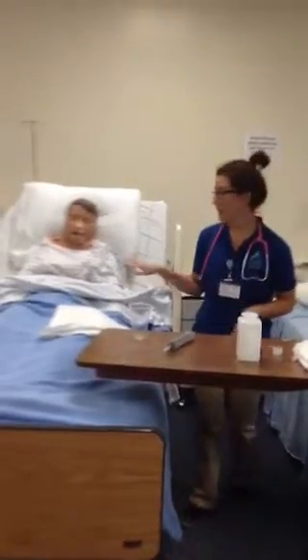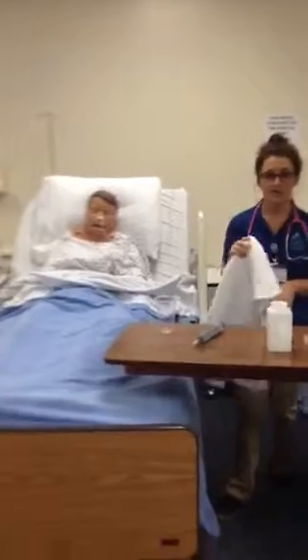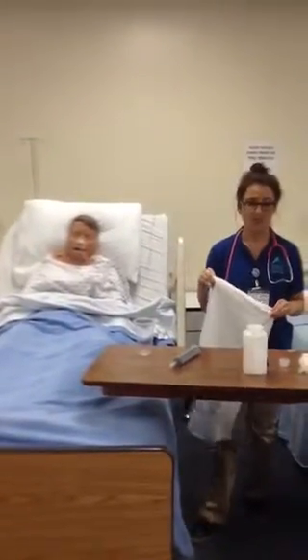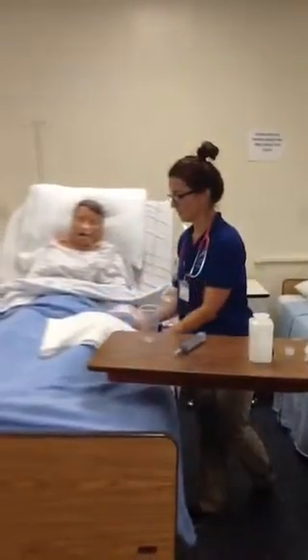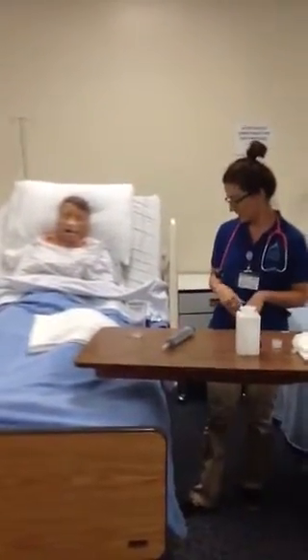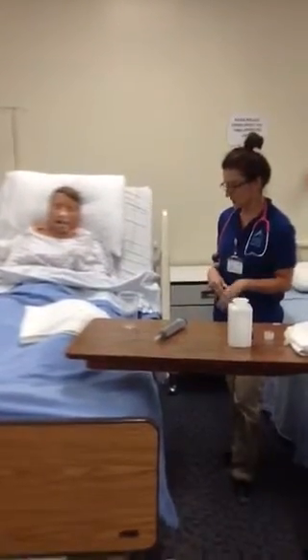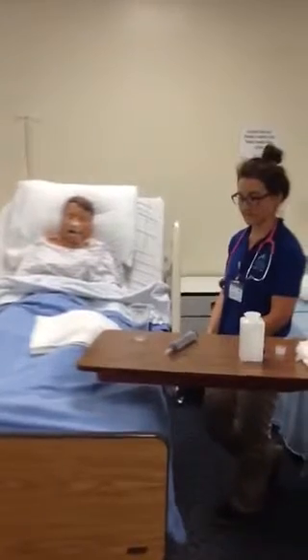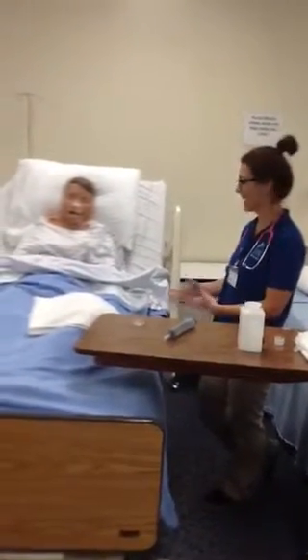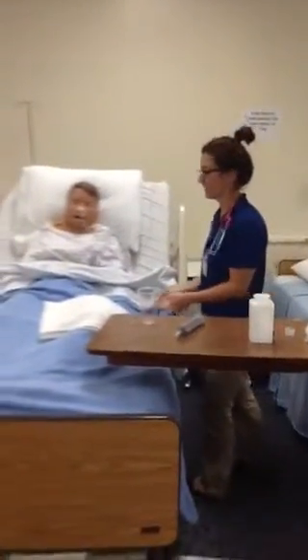So now I'm going to go back into the patient's room because he is experiencing some nausea and abdominal pain, and we need to irrigate. So I'm going to implement standard protocol by positioning the client into a semi-Fowler's position. Yes? Hi, Mr. Wilson. I'm Kristen. I'm back to irrigate your nasogastric tube to help relieve some of that nausea.